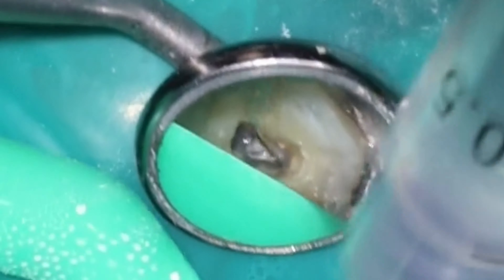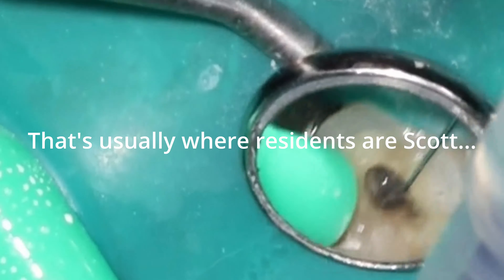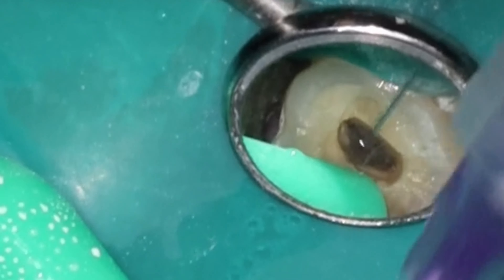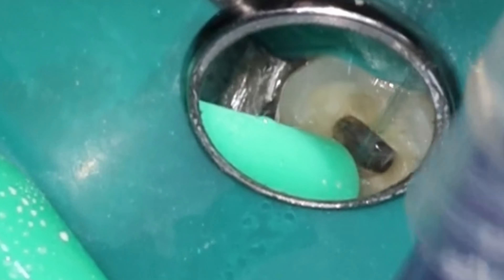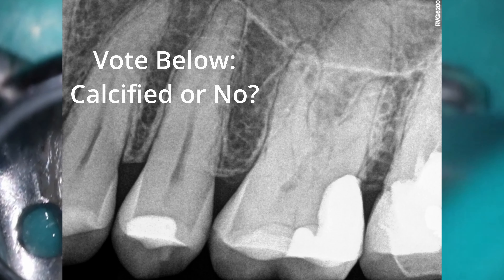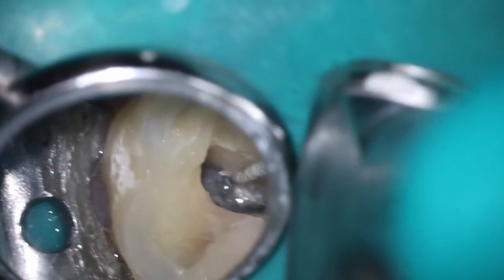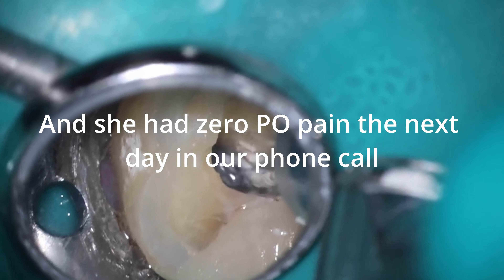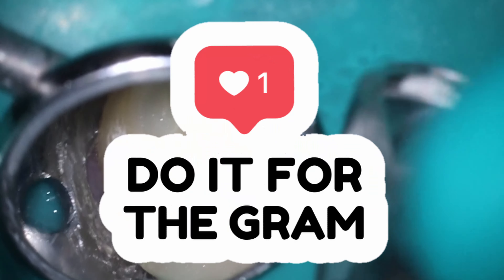Learn hand filing for sure. If you're a resident and you have a director who demands that you do this, do it — it's a really good skill. But for the vast, vast majority of cases — and this one has a little bit of calcification to it — I think a lot of people would say this is enough. I'll drop the x-ray here so you can judge: we were able to get patent, we were able to clean everything out, we have a pretty-looking x-ray.